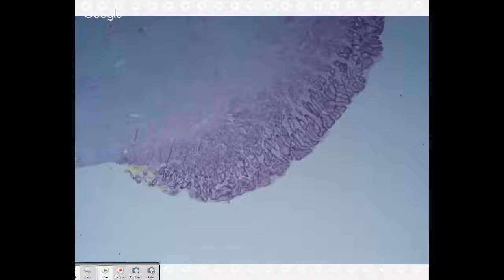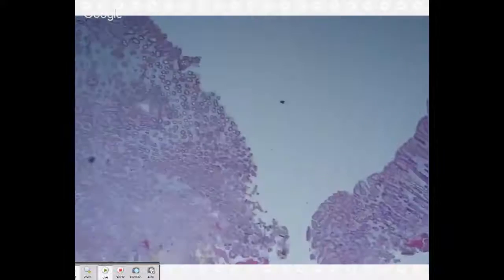They become large. They're most common in the stomach, especially when they're antral based, as you noticed, Emilio, that this one is antral based. They get polypoid and then they flop and they can cause gastric outlet obstruction. And so people can have nausea, people can have abdominal pain. It's not because they're doing anything nefarious. They aren't malignant. They're just getting in the way. It's kind of like a mass effect.